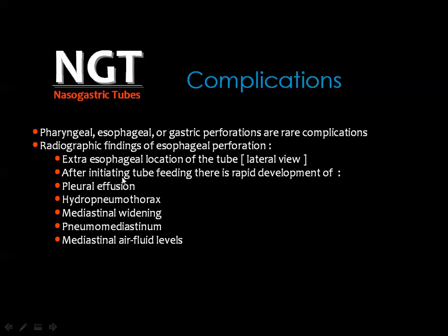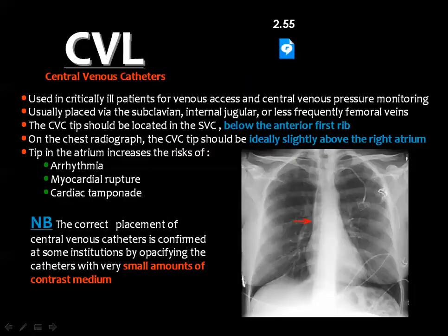And if you inject food or medications, there is rapid development of pleural effusion, hydropneumothorax, mediastinal widening, pneumomediastinum, or mediastinal air fluid levels.